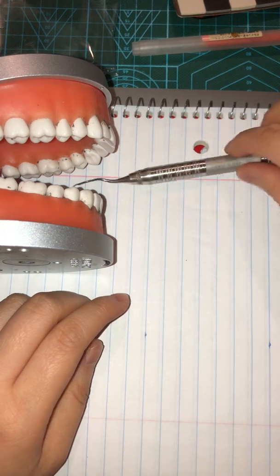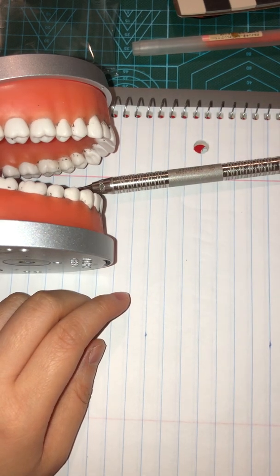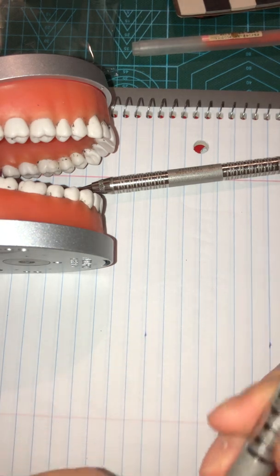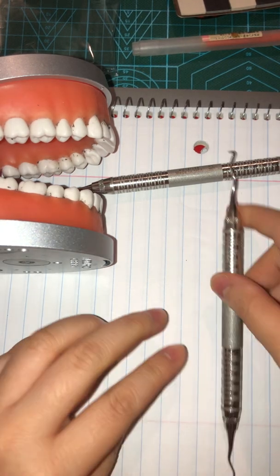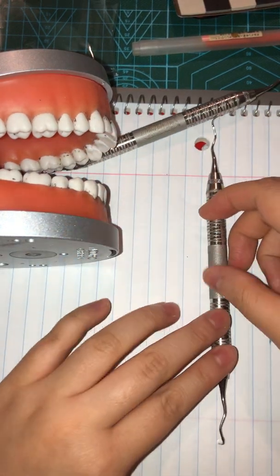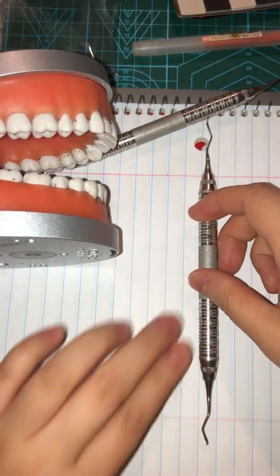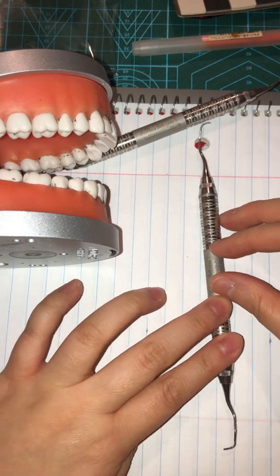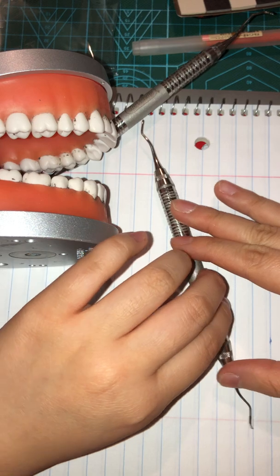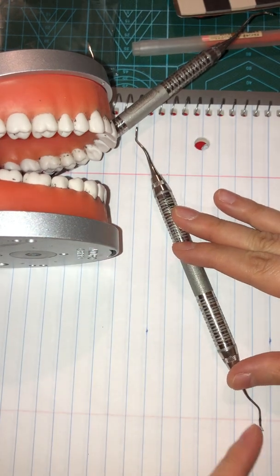And now for the 15-16, this is 15-16, you also want to look at the same working end, the V to the D, and then when you roll it, all right, now you look at the reflection, right?